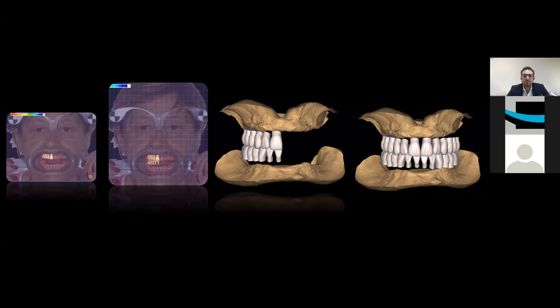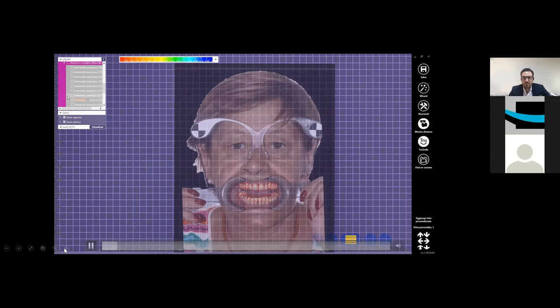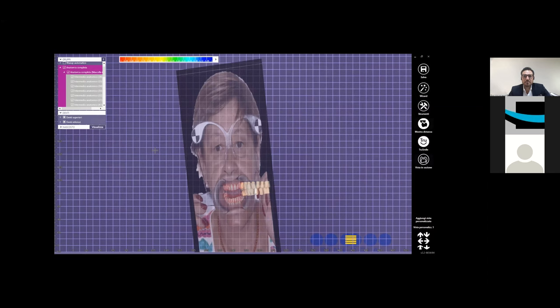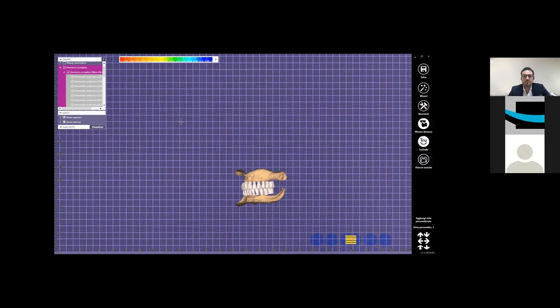Okay, so this is a preparation of a prototype by Marco Ortensi, and you can use what you want about teeth, commercial teeth. You can use a library from your 3D software, but the position is from DSS, from the final position in DSS. So 30 seconds about this video. This is the position of the teeth from the library inside the 3D software with DSS, like a guide for the dental technician. This is very important. And now I can transfer this phase to a 3D printer, so I can get one or two or more prototypes, and I can check this prototype inside the mouth.